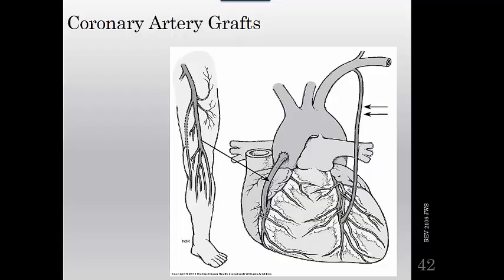So compared with angioplasty alone, stents open the diseased segments into a rounder, bigger, and smoother opening and reduce the chance of restenosis. However, stents cannot be used in all situations. For instance, stents are difficult to place in arteries that have extreme bends, and they cannot be used in very small vessels. So we need to know what they're going to look like when we're finding them, and we'll go over that when we get there.